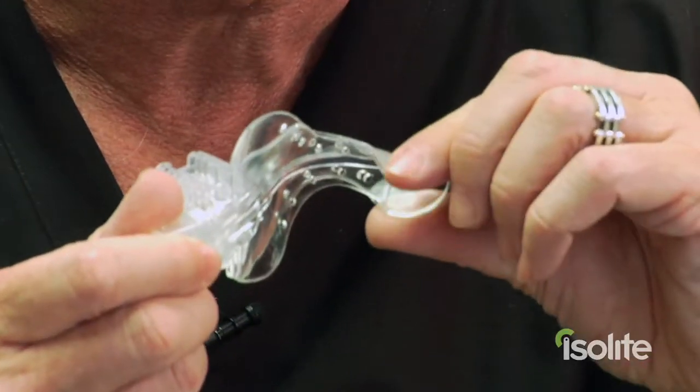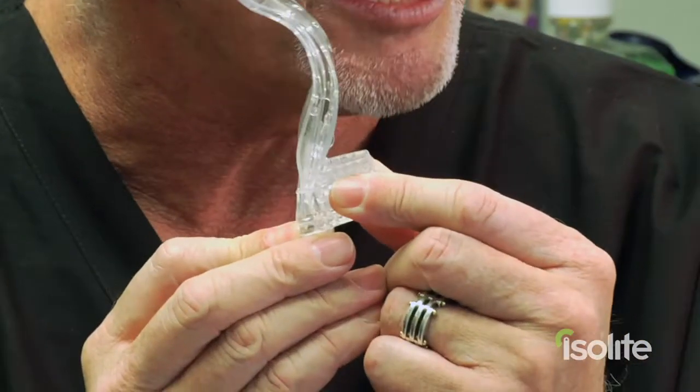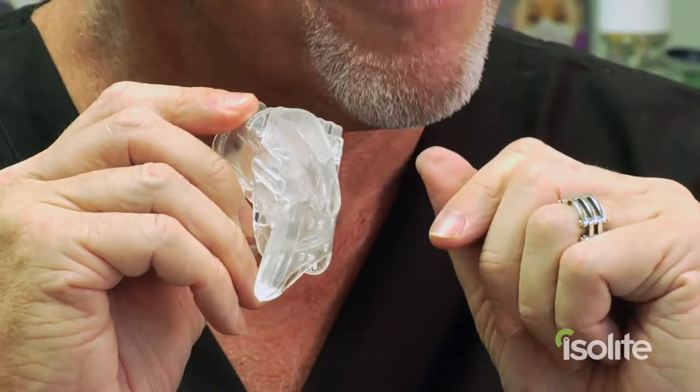The first thing you'll notice is that it's very soft and very flexible and easy to the touch — there's nothing hard or pokey about this whatsoever. We have the soft bite block: it's soft, it's flexible, and it's a patented bite block. The great thing about the flexibility of this bite block is the patient can actually rest on it and flex their jaw, so you never have any static fatigue.